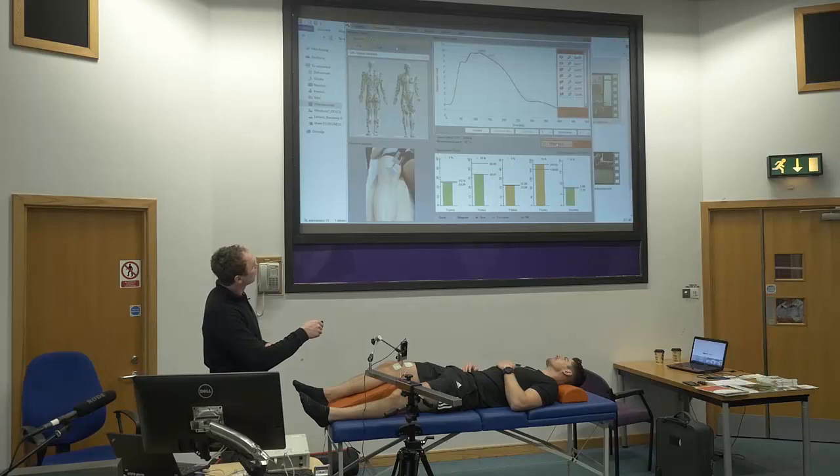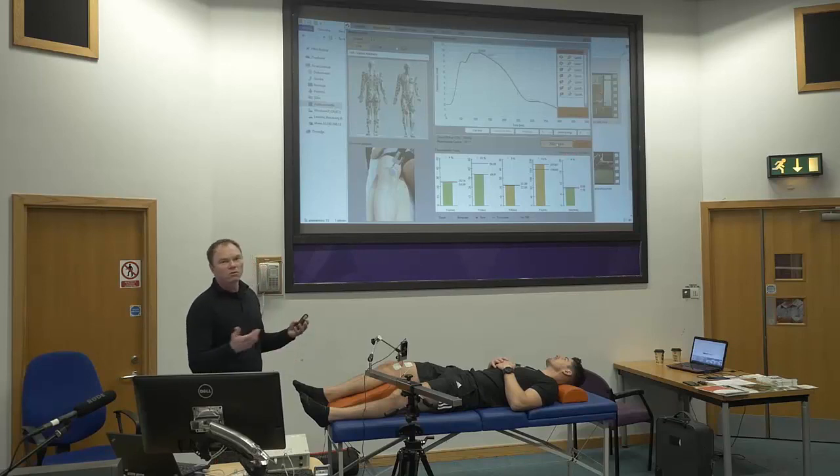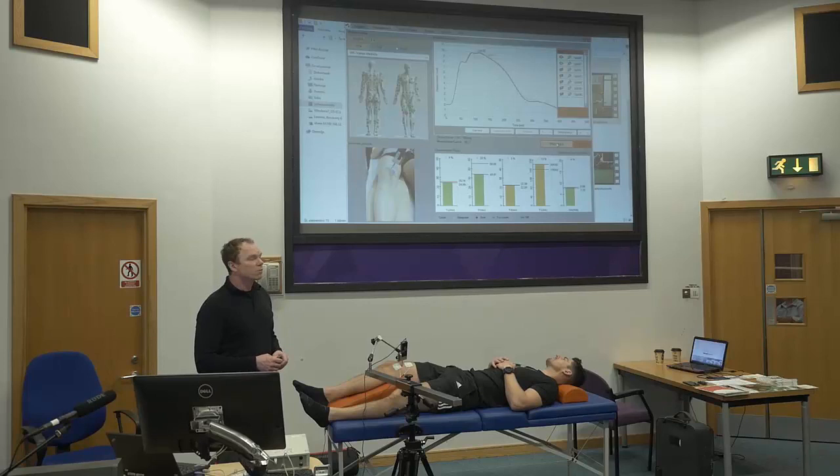We had seven measurements; the last one is on top and is the one I'm interested in. I'll click 'Save Last' — everything else will be deleted, leaving just the last measurement. As feedback: the muscle is 4% faster than the average value — his value is 24.6, the average is 25.7. Displacement is just about normal, optimal. It's only 4% different from the average, with a lot of green color. I would consider this quite a nice response. That's the protocol for measuring one particular muscle.